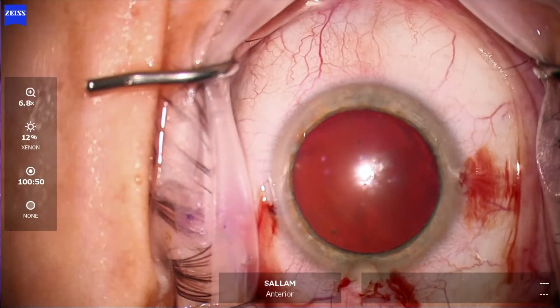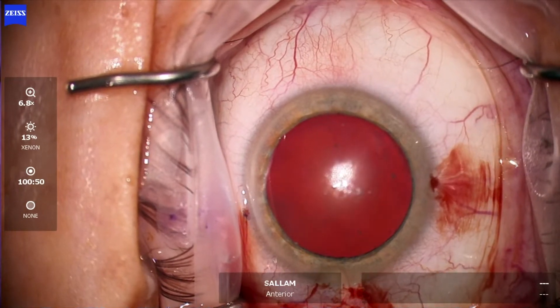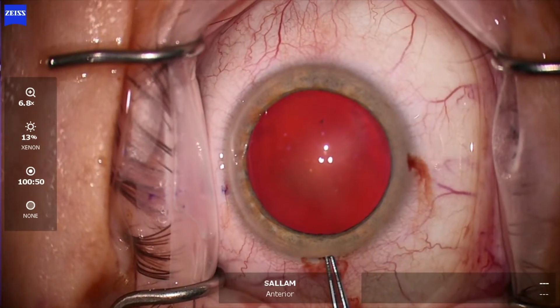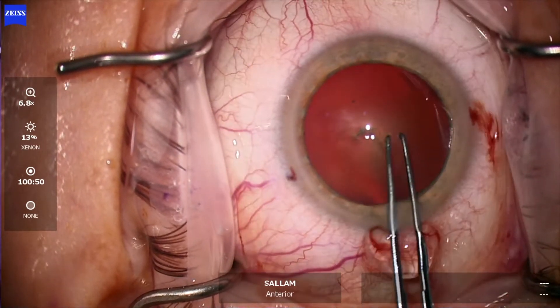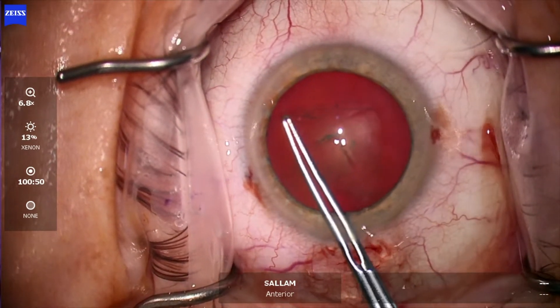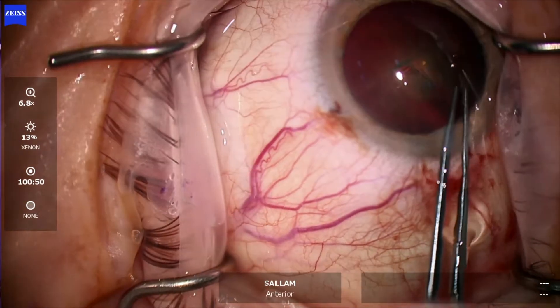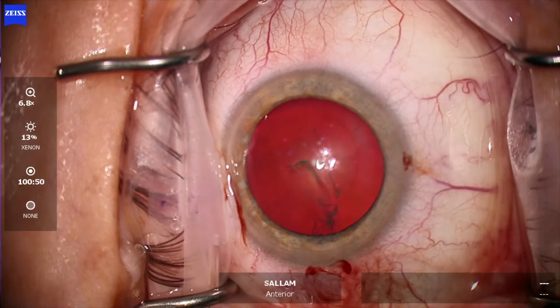Some inefficiency here trying to locate the capsulorhexis forceps — we found it. The cornea is a bit dry, so washing the cornea, now back with the forceps. The technique here: we start in the center, do the first 90 degrees, then re-grasp. This is a perfect position — just continue and curl. I should have re-finished here, but re-grasping in a place which is not very ergonomic, and as you can see, some burping of viscoelastic, but finishing off.